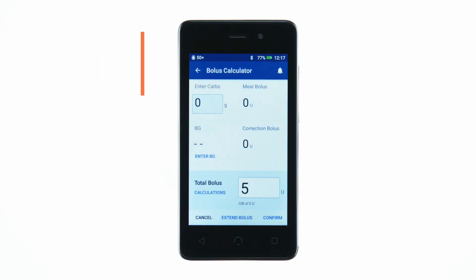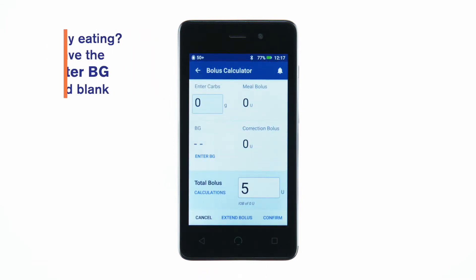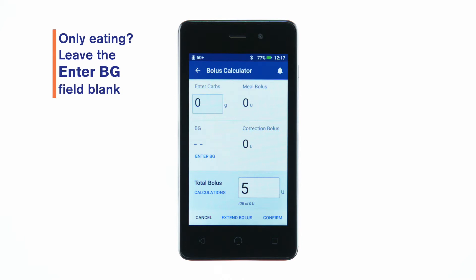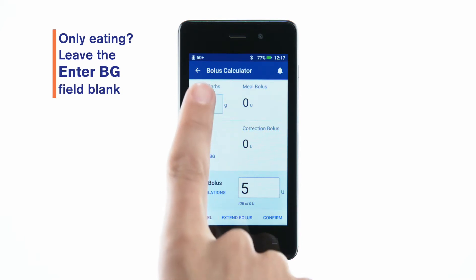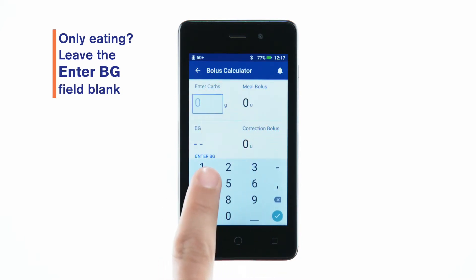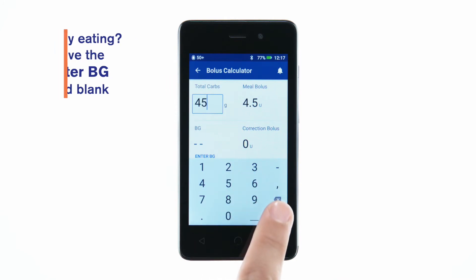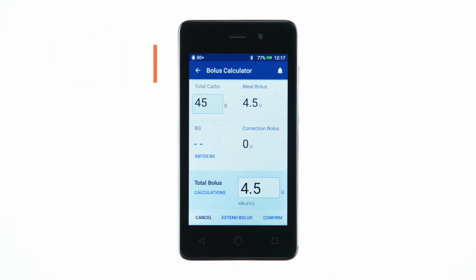If you'd prefer to have the bolus calculator calculate the bolus dose, tap the Enter Carbs field. Enter the grams of carbs and tap the check mark.